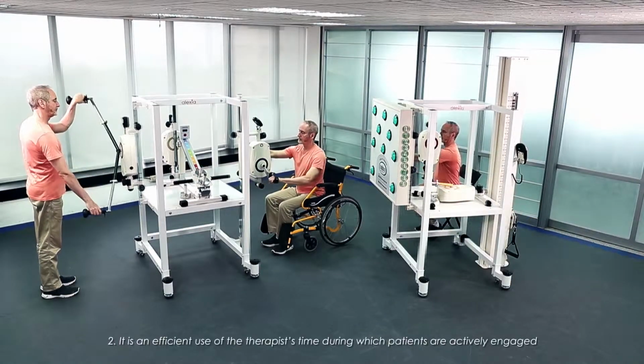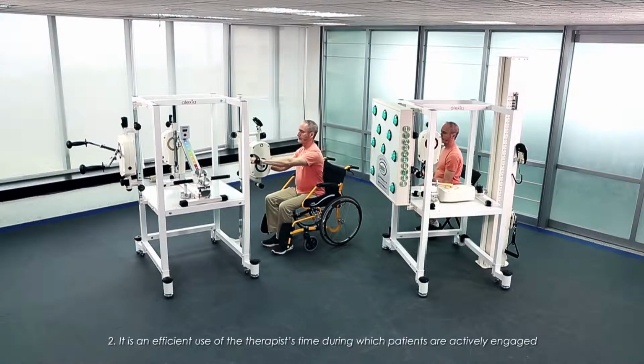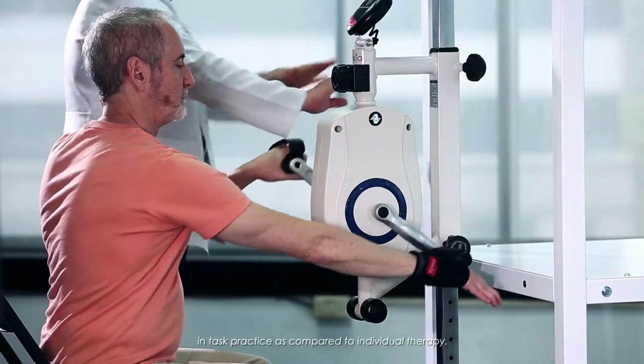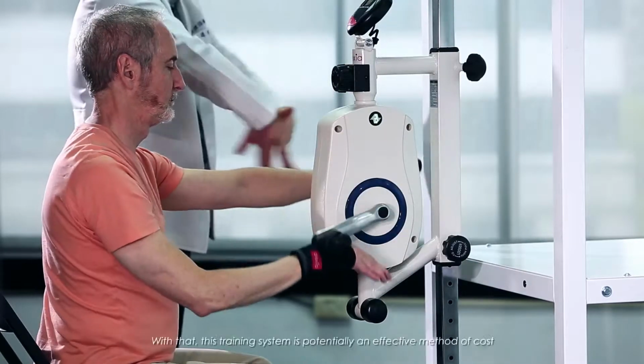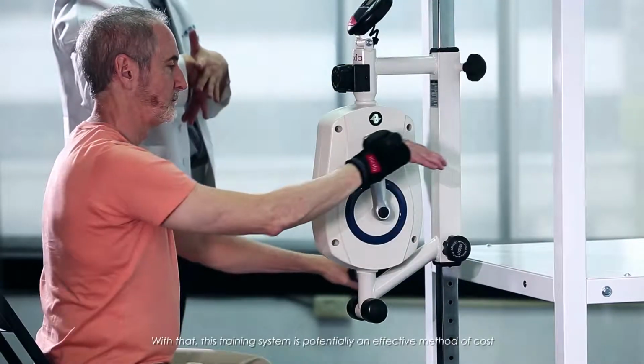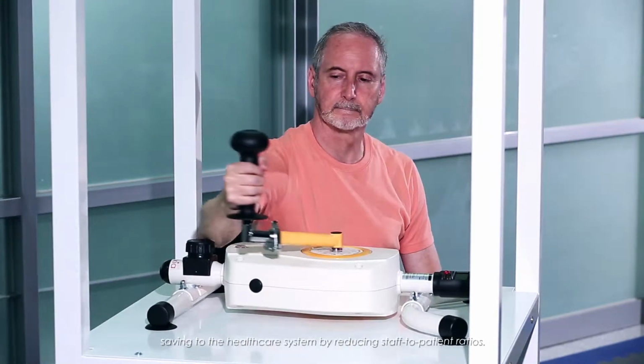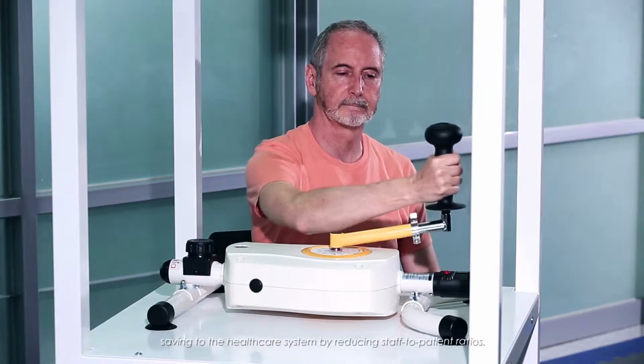2. It is an efficient use of the therapist's time during which patients are actively engaged in task practice as compared to individual therapy. With that, this training system is potentially an effective method of cost saving to the healthcare system by reducing staff-to-patient ratios.